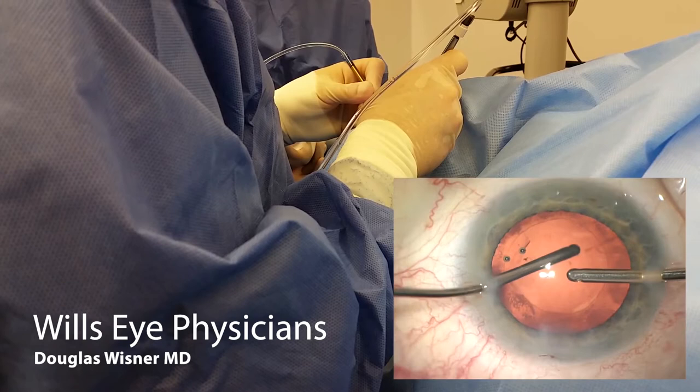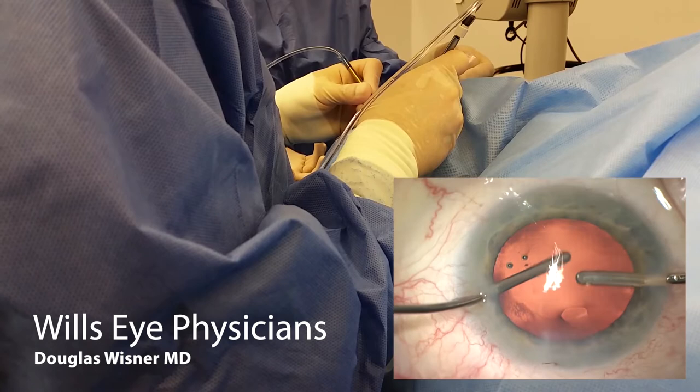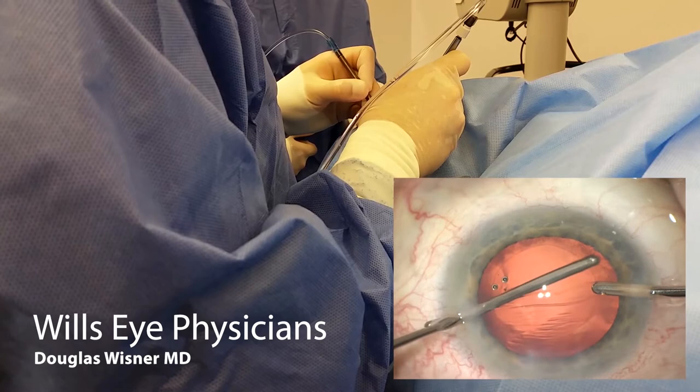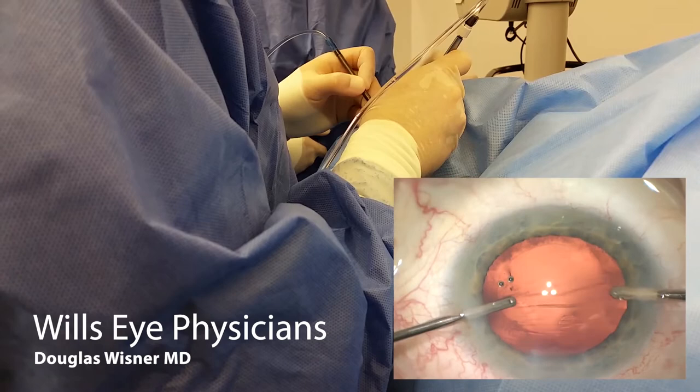I'm quite happy with this. You can polish with bimanual IA. If you're using a reusable bimanual IA, just make sure that it's well taken care of by your sterile processing. Any metallic burrs on the aspiration tip can tear the bag. Always come out with aspiration first. You can also polish the underside of the bag. Just flexing around with a little bit more cortex here.